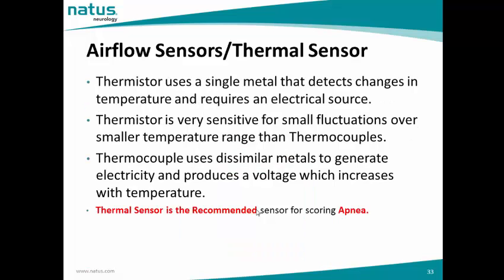Thermistor uses a single metal that detects changes in temperature and requires an electrical source. Thermistor is very sensitive for small fluctuations over a smaller temperature range than thermocouples.